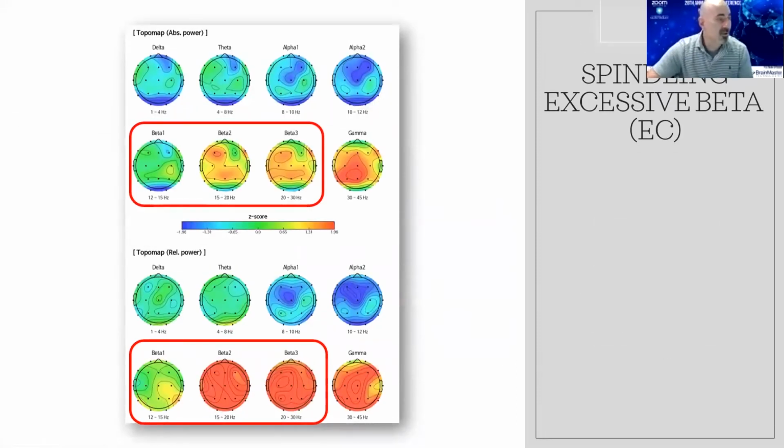So here's what it looks like in the EEG, in the flat maps. We are looking at the 15 to 20 hertz bin. If we look this out, we're at about 1.3, so in the 70th percentile, plus or minus, maybe 80th percentile, maybe even deeper, really. For excess beta, we see it frontally. This is a pretty neurotypical presentation for beta spindling and depression.